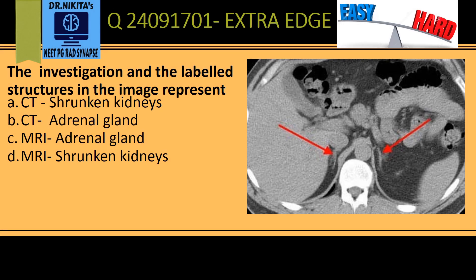To answer this question, the first thing we have to do is identify whether this is a CT or MRI. The trick for that is to first look at the bones. So these are the vertebra, these are the ribs — the bones are looking white. Therefore, this is a CT scan. So option C and option D are automatically ruled out.